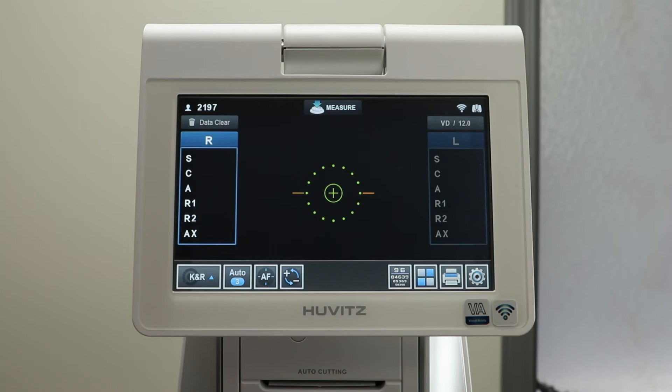In the top right corner, you will see the Wi-Fi icon and the digital refractor icon. This shows that the system is connected.